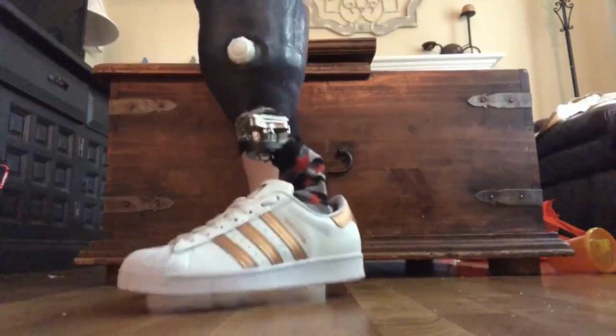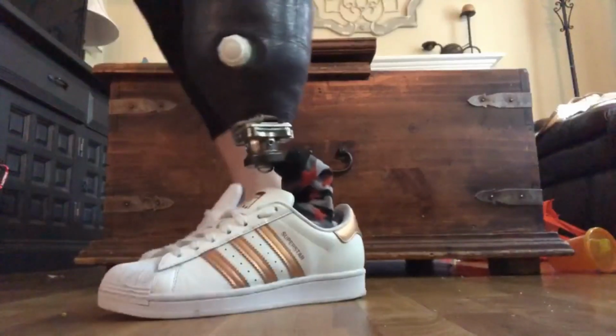I also have different size rings. So this ring is the one that I use in the morning. It's fairly flat. And this ring is the one that I typically switch to in the afternoon because it has a lot more fluff in it and it makes suction easier. As my limb loses volume, I start to lose suction, which makes that squeaking sound or the air-like sound, almost like when people say that their leg is farting, that's what they mean.